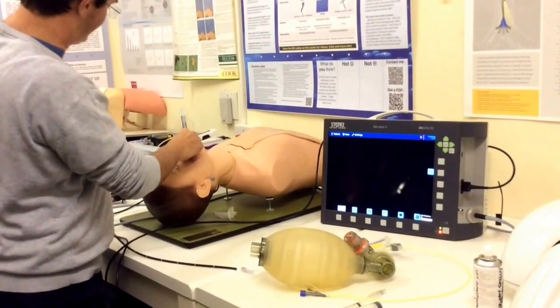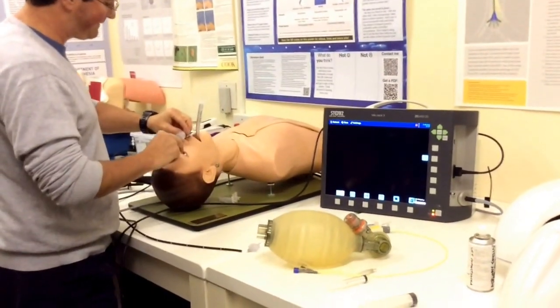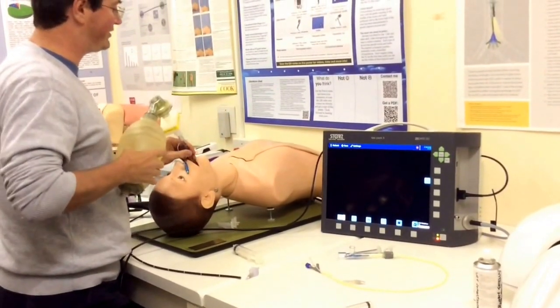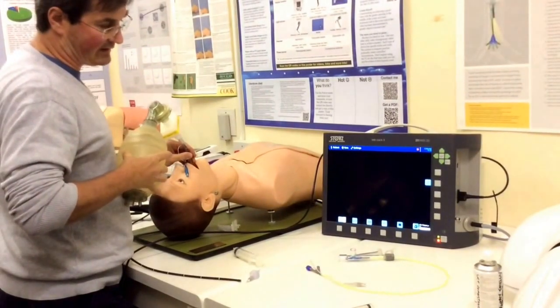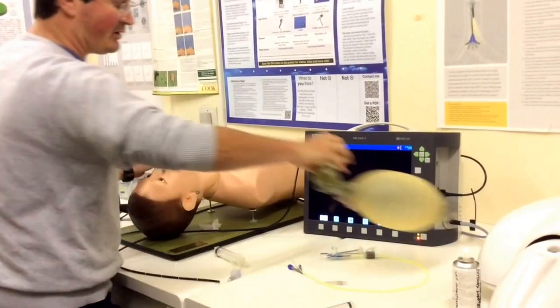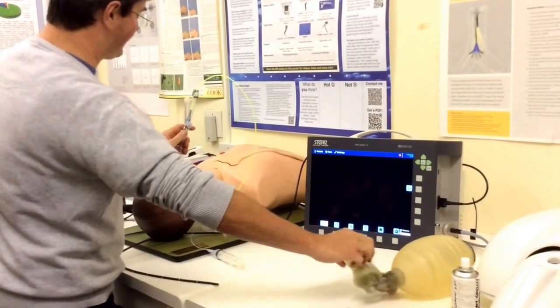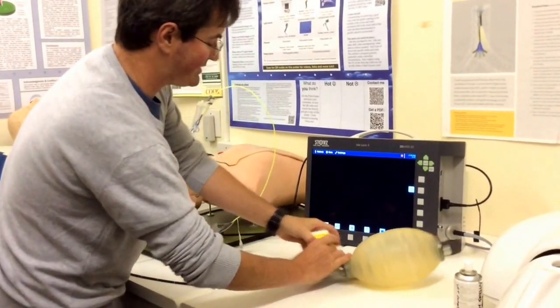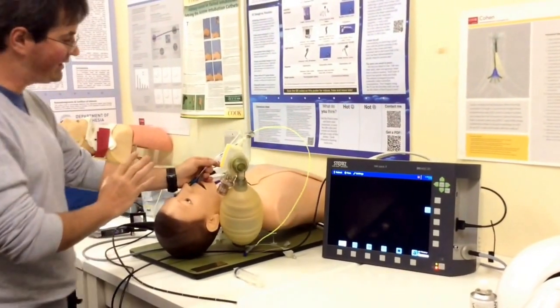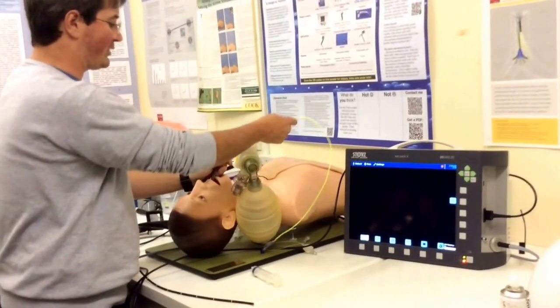I'm going to inflate my cuff and confirm position and ventilate. I would usually connect the patient to my circuit and anesthesia machine. This model has a bronchial tree rather than lungs, so you can't see the chest move. I secure my tracheal tube, connect the wire connector, put my ventilator back on, and ensure we're ventilating the patient with everything stable.